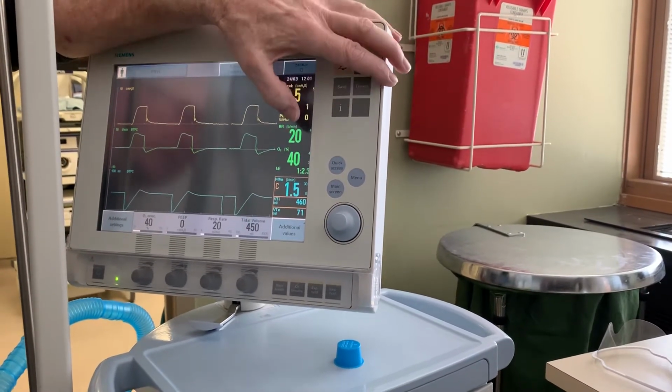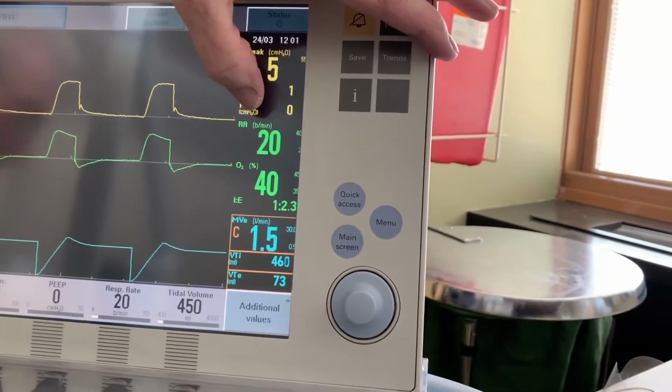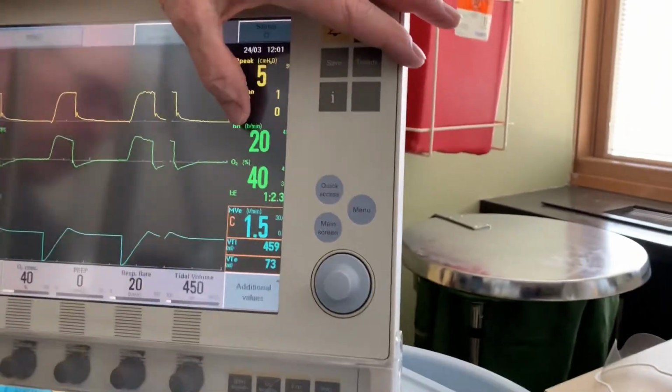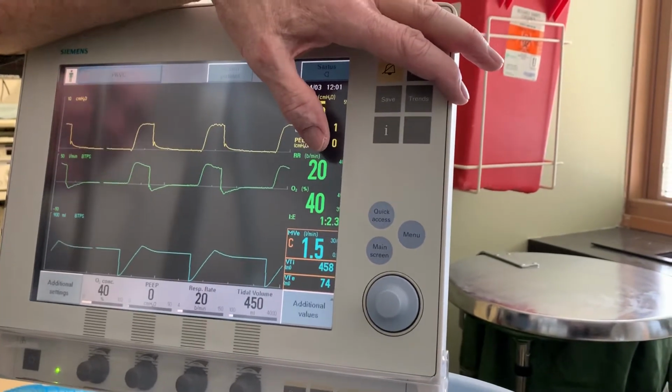The numbers that you see below this, the respiratory rate, that would be the total respiratory rate, the set machine volume, and how much the patient's taking. So if this is set to 20 and this is reading 30, that's saying that in addition to the 20 breaths, the patient is taking 10.